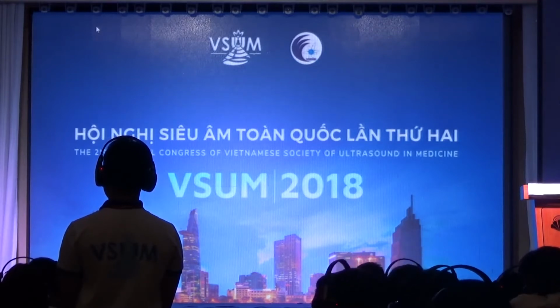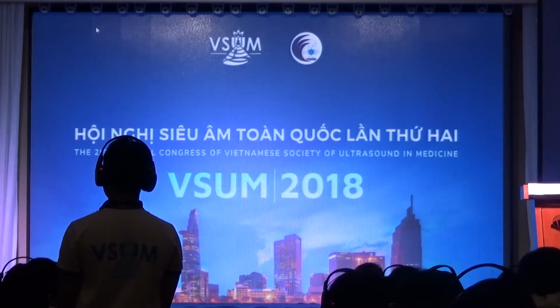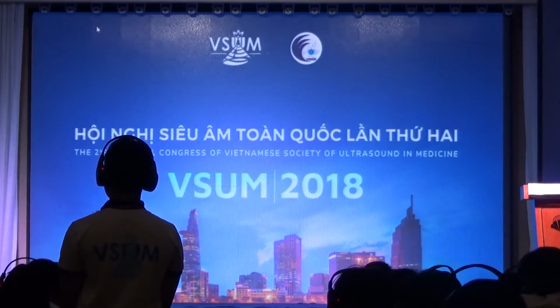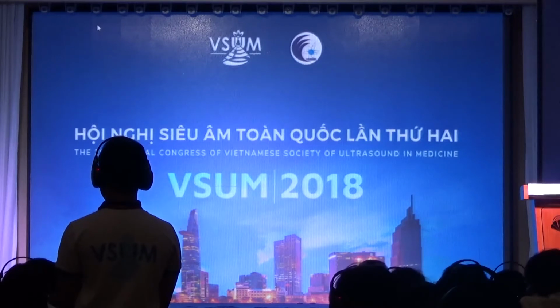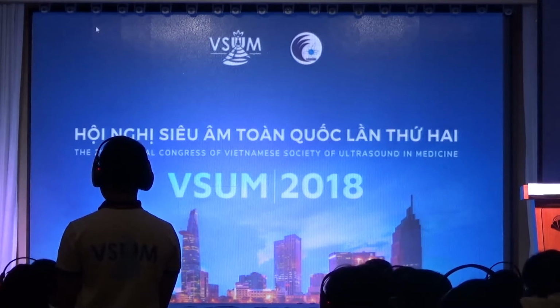And most of the time, what we need to know to treat the patient is, are they cirrhotic, are they normal, or are they in the middle? So we think that's a very good way of doing it. And the WFUMB guidelines are going to come out and we're discussing another simplified way to say rule in or rule out. So if you have a value that's very low, let's say below 5 kPa, we can say that patient's normal. If they have a value between 5 and 10, they have a very low probability of having cirrhosis.